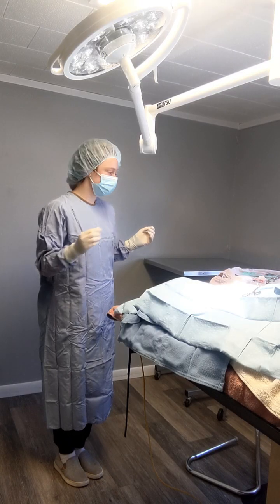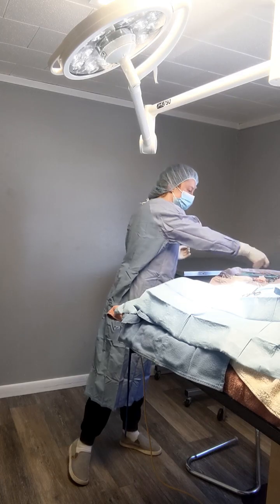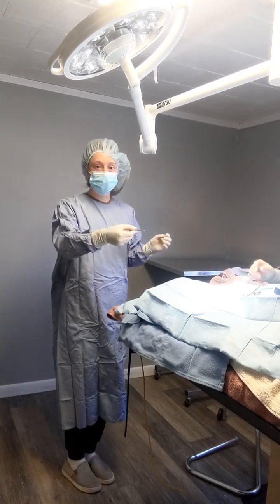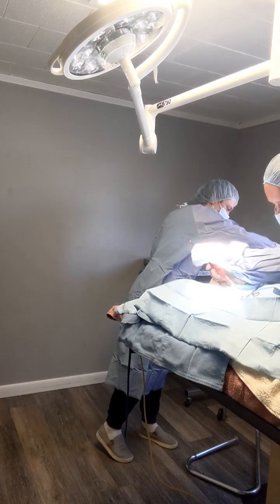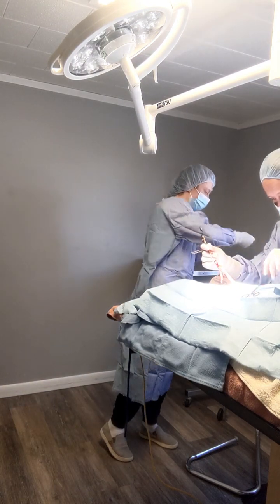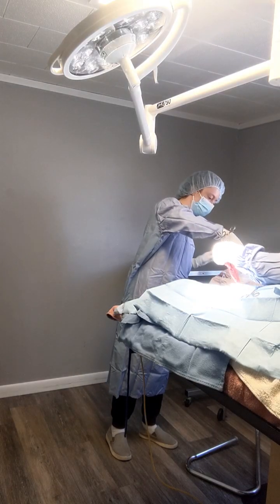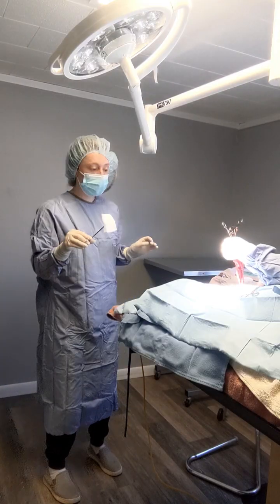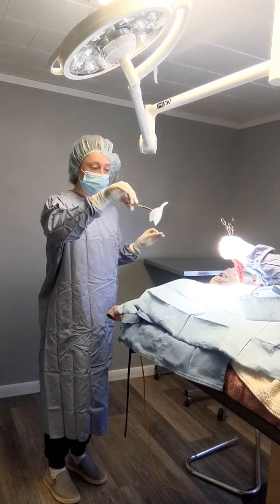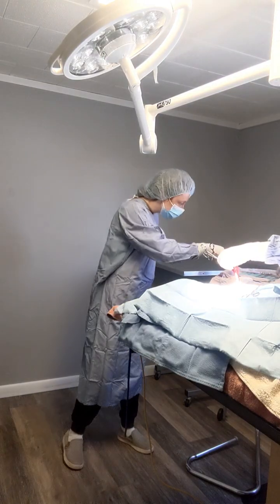Okay, I need to cut this. I'm gonna need my blade and my thumb forceps. Okay. So for the blade, I want to do the point towards me and the blade away from my hand. Yes, yes, yes. That would be perfect. Okay, so I'll just use the hemostat to pick up gauze, and I want to make sure I clamp it. So if I do need to dab any excess blood, I would do that without touching anything else.